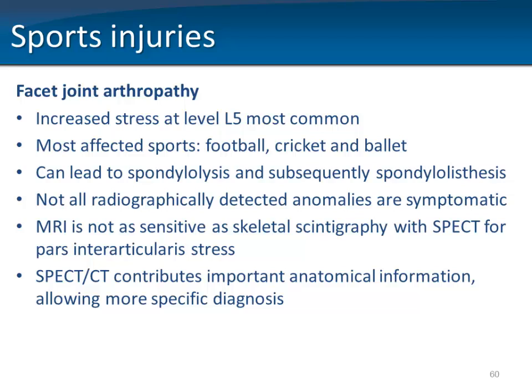So facet joint stress is also very common, and what you see most is the L5 level. And most affected sports are very much ballet, which I see very frequently because we have a Royal Ballet School where I work in the city. Football and cricket I see less frequently. And it's important because it can lead to spondylolysis and subsequently spondylolisthesis. And again, these are not typically detected radiographically, and MRI is not so helpful either.